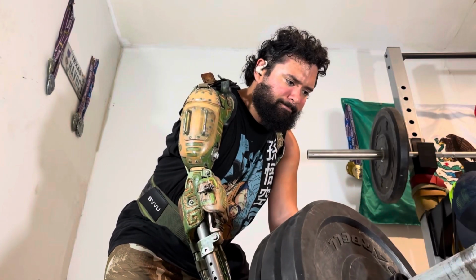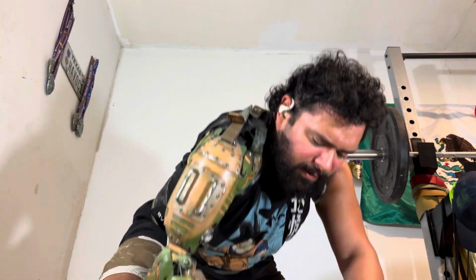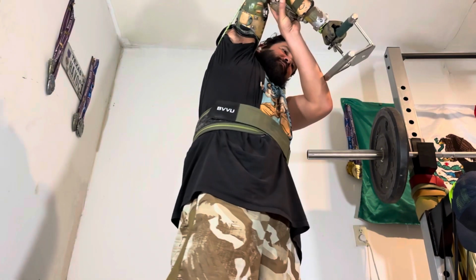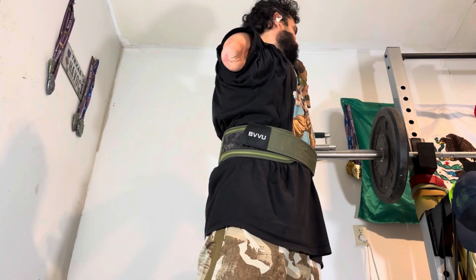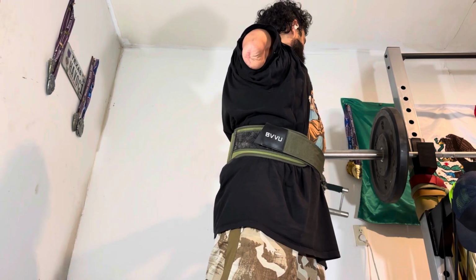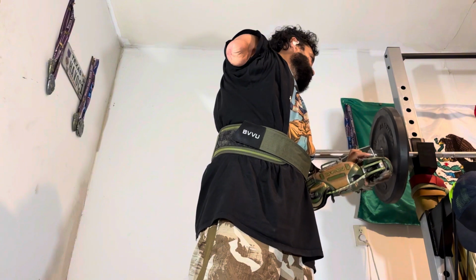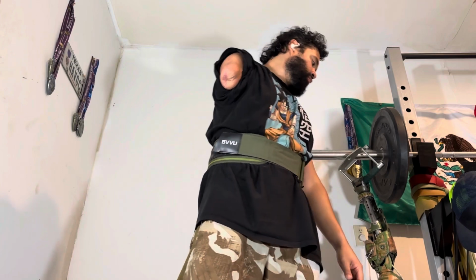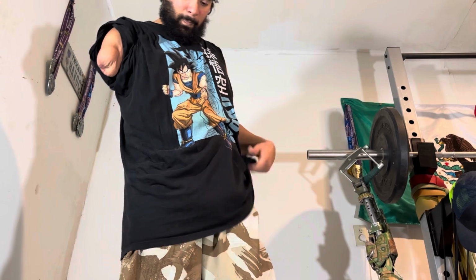And here I'm using both arms, lat pulls, and this is only, what's that? 25, 50, plus 15, 65 pounds. And some people have questioned the weight limit of this arm, and I know a lot of people reference a New York Post article about it, saying 400 pounds. And I would say that the weight limit is 400 pounds, but that's limited by my own strength. And that's just how much I've ever tried to lift with it. And that was just a straight deadlift.